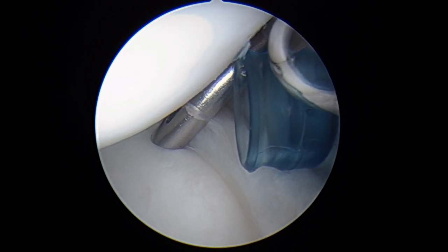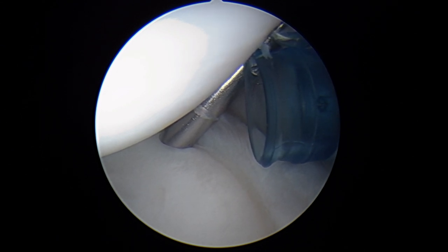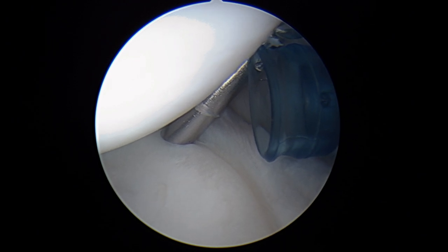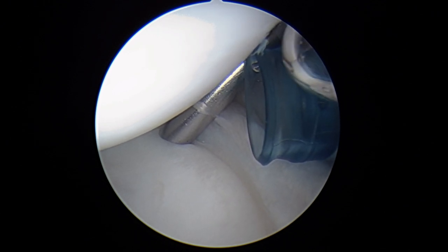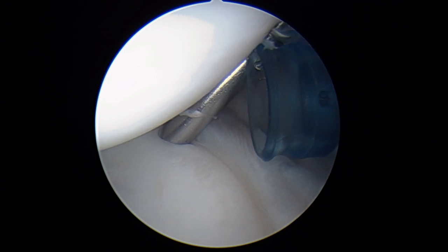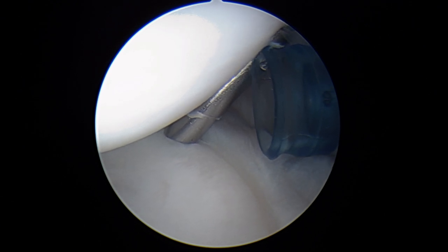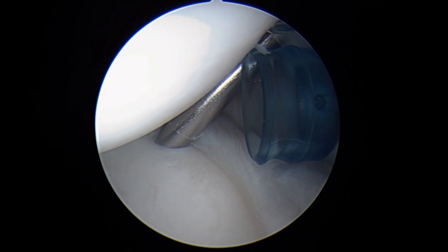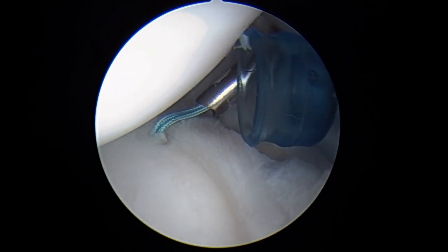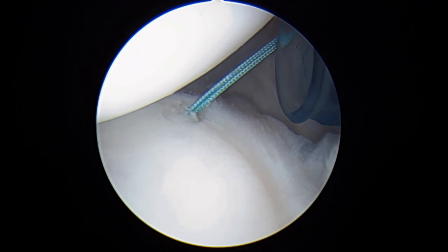We've got a guide in position and we're going to go ahead and drill all the way down into the bone. And then into that hole we're going to place a suture anchor. Once it's down, we can unload it, and there you can see two sutures coming off of the anchor. We'll pull back on the sutures to seat it, and that now feels very solid.